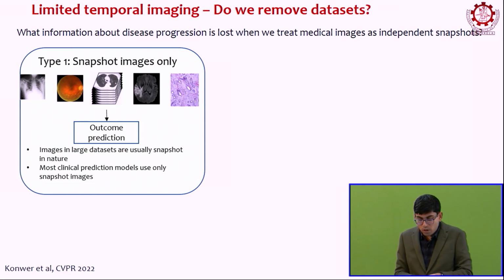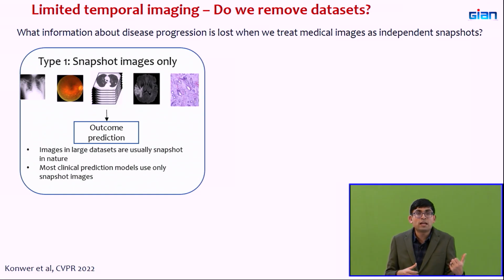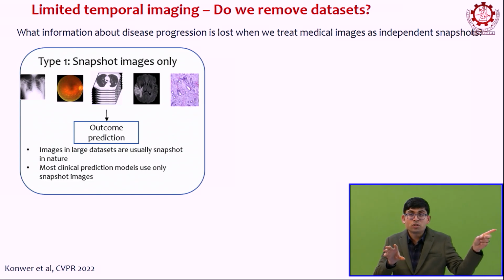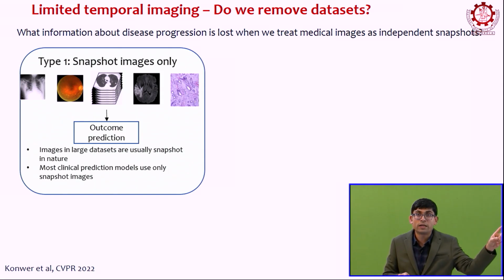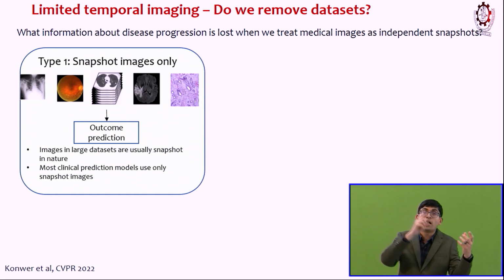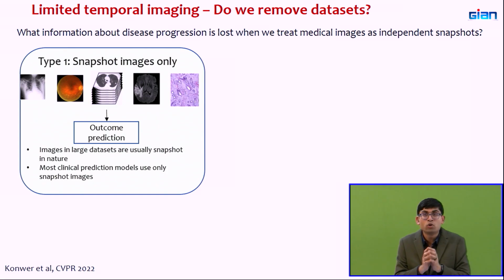I am a patient who comes in today, my doctor looks at my image, and maybe my doctor does not have access to my previous images, or maybe I do not even have previous images that have been collected. But there will be other patients whose images look similar to mine, and those patients will have previous images collected. So, the doctors can actually contextualize your image with respect to serial images of other patients, and that is the idea that we try to bring into this piece of work.